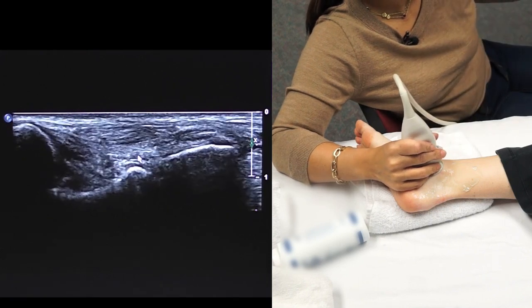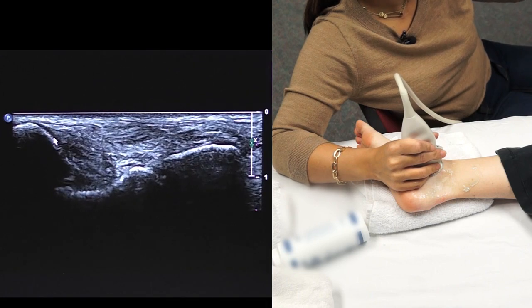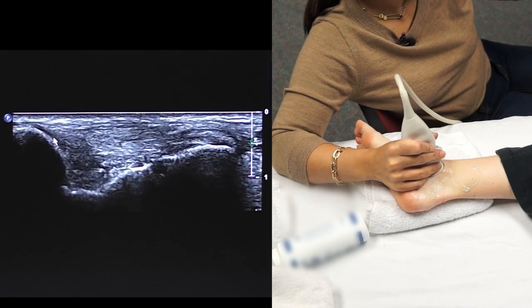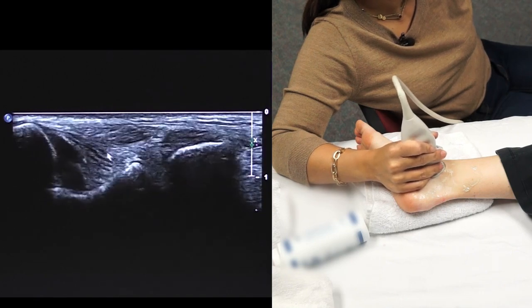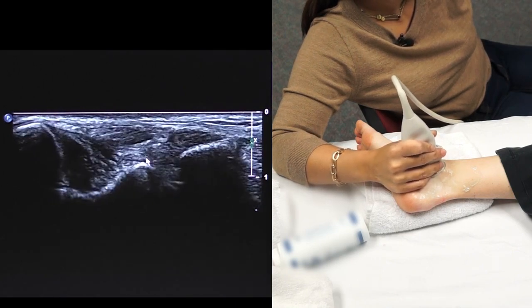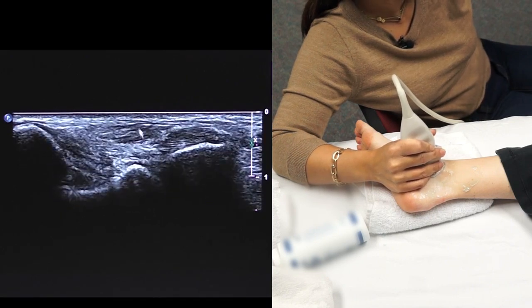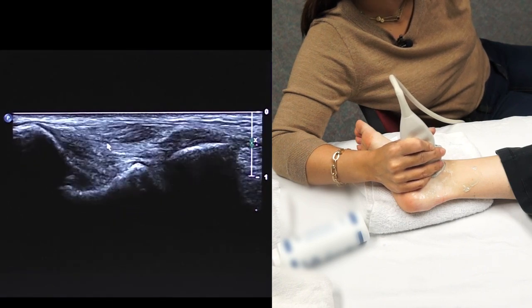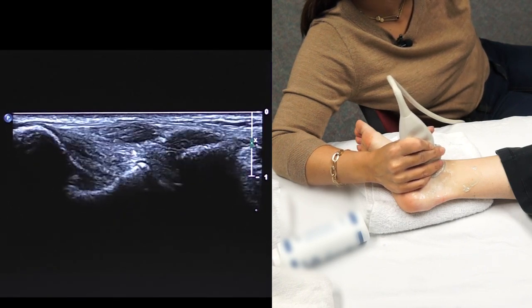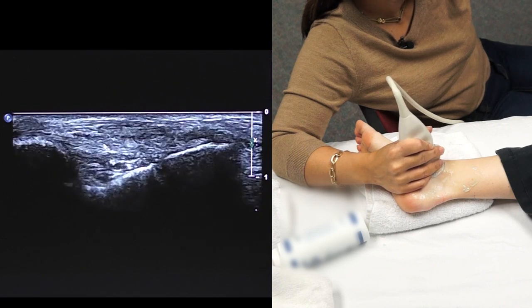And you would look for a ligament extending from the medial malleolus, hanging off of that, and look for various attachments in the ankle. Here we're looking at an attachment on the sustentaculum. You can also see that it is deep to the posterior tibialis tendon. So you're looking for these fibers that are extending inferiorly from the medial malleolus. And if there is abnormality, again, you would lose echogenicity and lose architecture in that ligament.